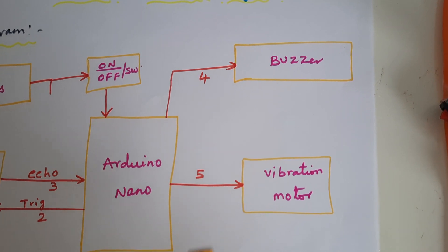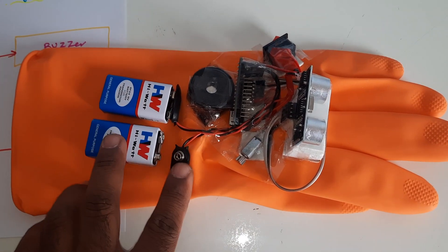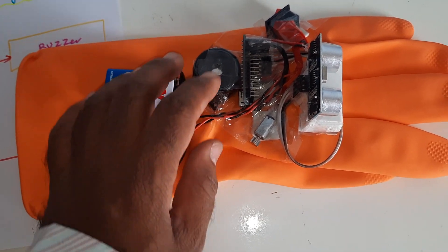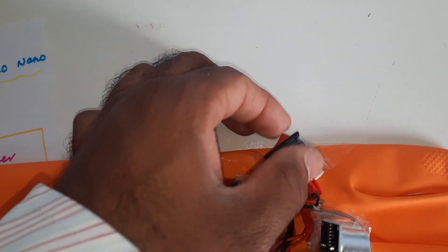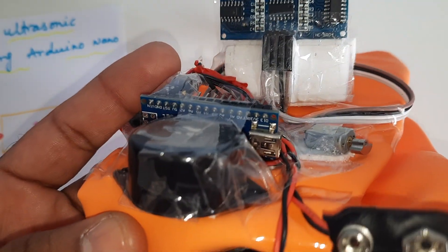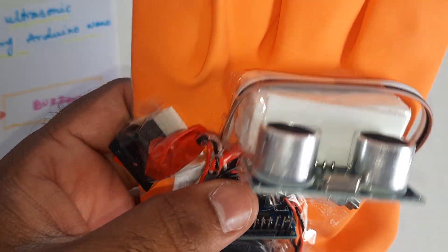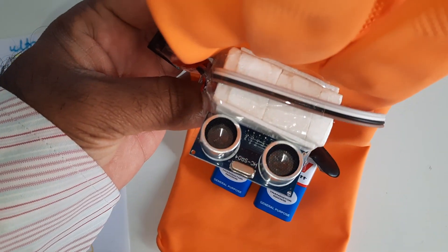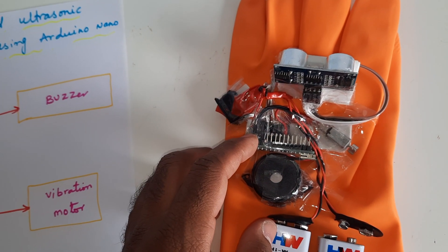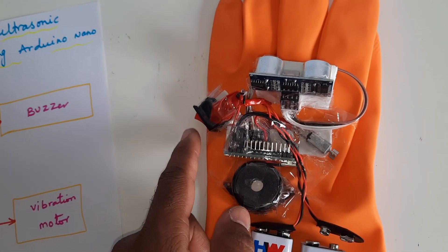Now let's look at the hardware. We are using two 9-volt batteries — if required, a second one can be attached. We also have an on/off switch button, the Arduino Nano board, a vibration motor, and the HC-SR04 ultrasonic distance measurement module. So the components are: ultrasonic sensor, Arduino Nano board, vibration motor, alarm buzzer, and switch button.